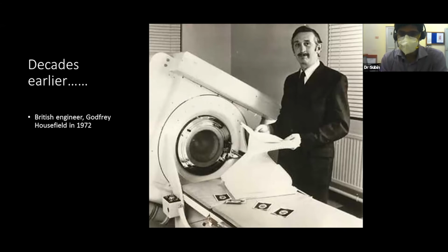As compared to now, we have modern CT scanners which take the whole picture of the moving heart in less than 1 second.